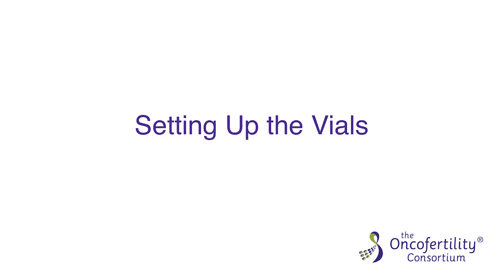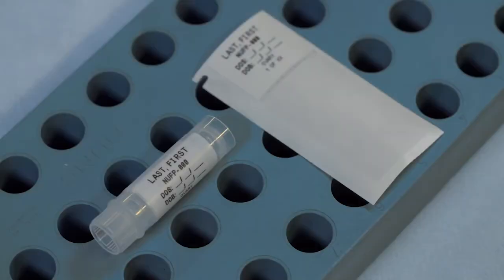Setting up the vials is the first step. It is recommended that you use a mechanical labeler because of the amount of information that needs to be on each label.